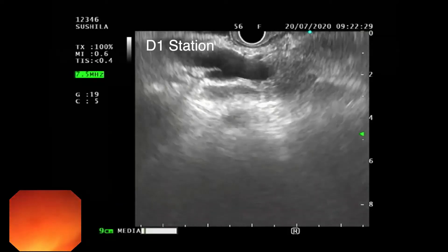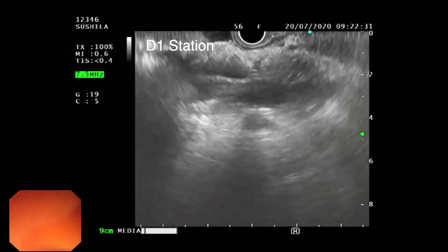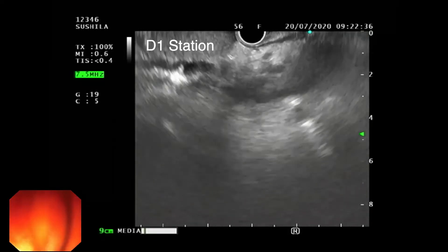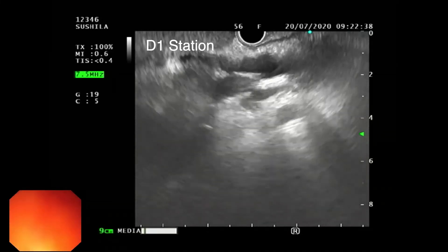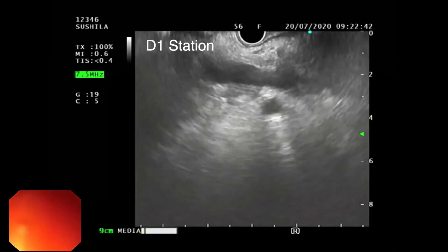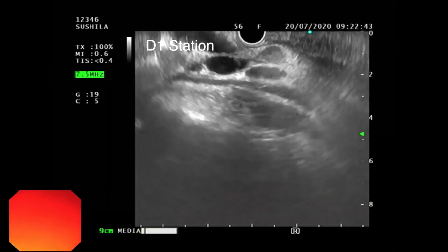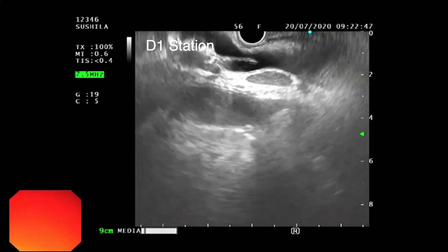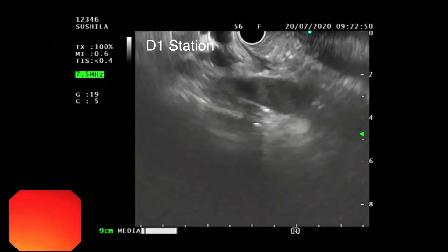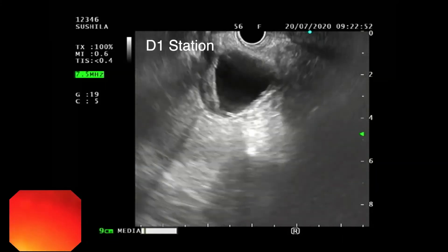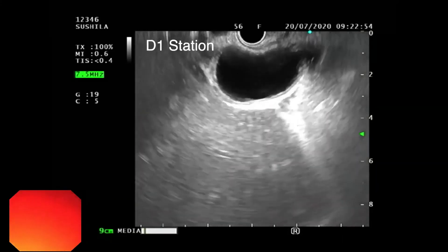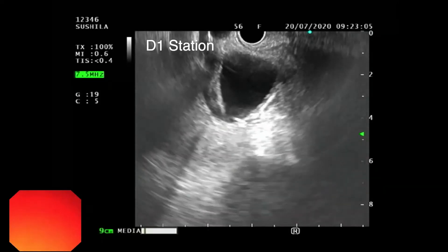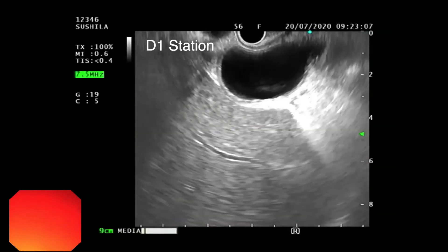Again, by doing the anticlockwise rotation, you can reach towards the hilum. This is the gallbladder.